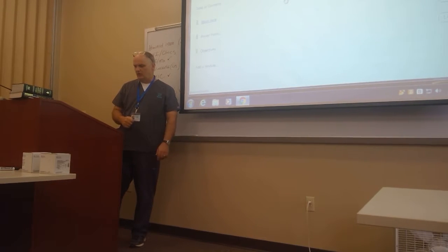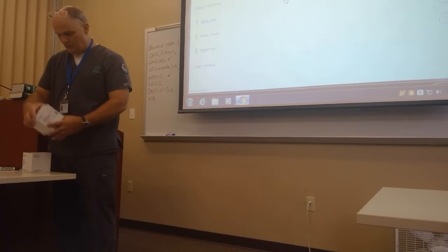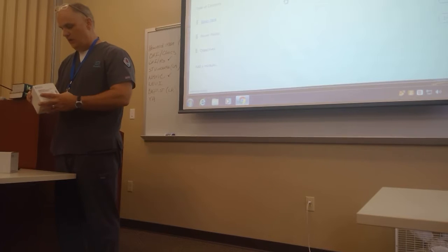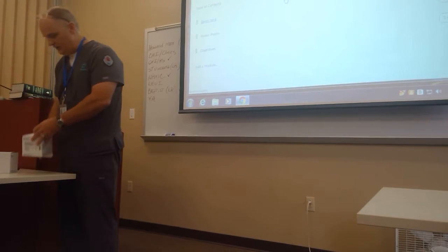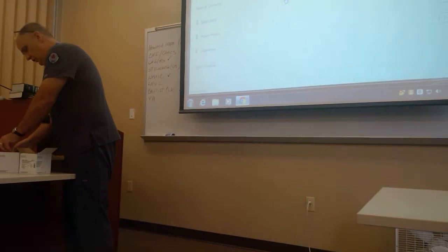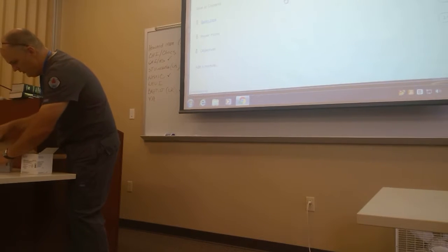The first thing we're going to talk about is external QC when it deals with urinalysis. I don't know where you guys are going to end up working or doing your clinicals, but this is what we use, and it's what I used at St. Joe. These are the QC bottles from a company called Cova, a brand new thing that just got in.